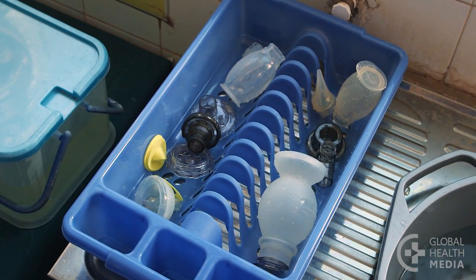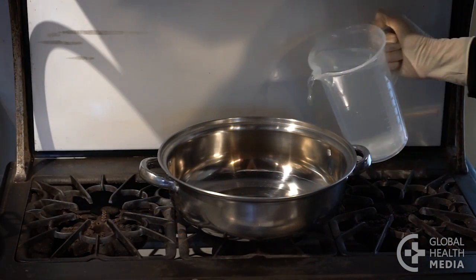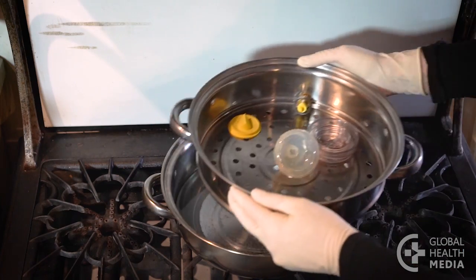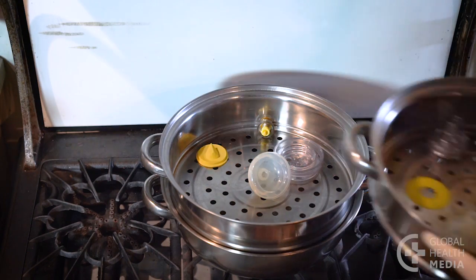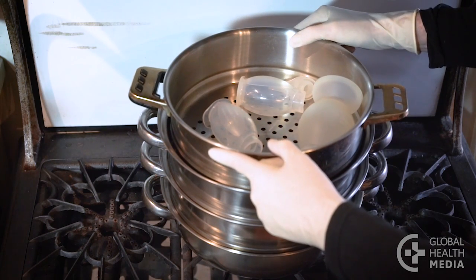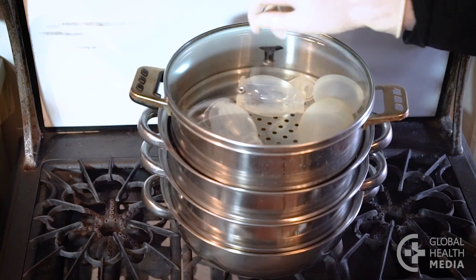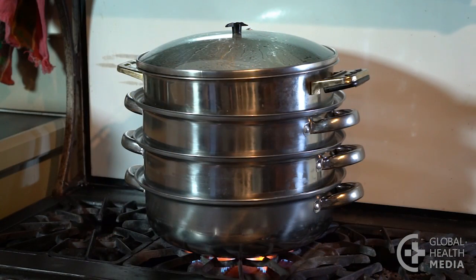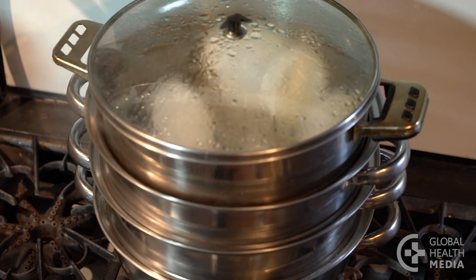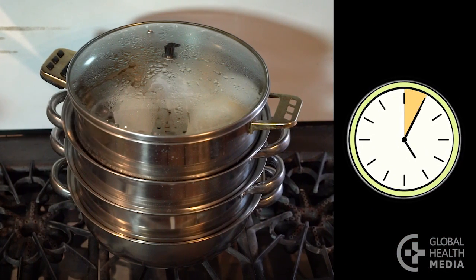Now the equipment is ready for disinfection with steam. First, fill the bottom pot with a litre of clean water. Then stack the steamer pans with the pots and put the lid on top. Bring the water to a boil. When the steam starts to come out between the pans and the lid, start your timer. Steam the items for twenty minutes.